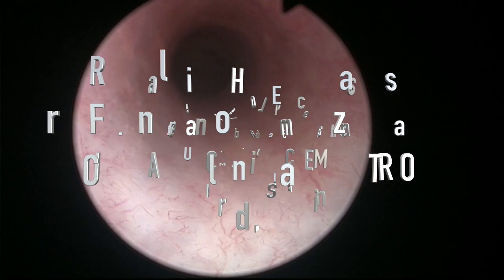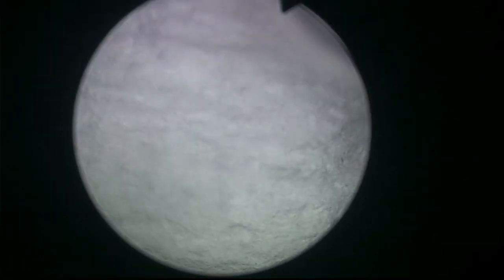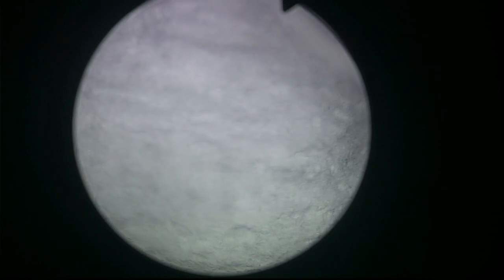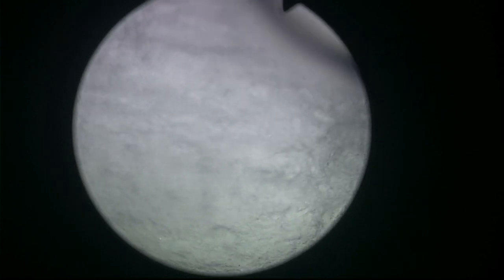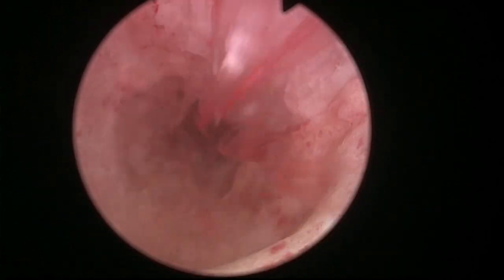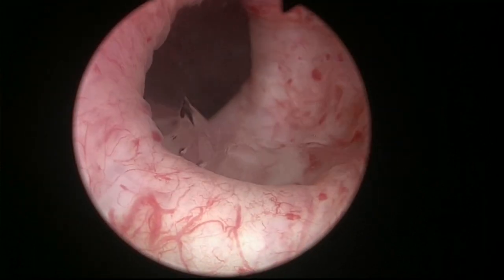The urethra is a little bit tight on the scope, so I'm going to do an Otis urethrotomy. It's a normal urethra, but it doesn't have the caliber to allow the scope comfortably. So I'm going to do a mild Otis urethrotomy. The Otis urethrotome is a device that makes a cut in the urethra anteriorly. You see, at 12 o'clock it cuts the mucosa, and that gives the urethra a much better caliber.